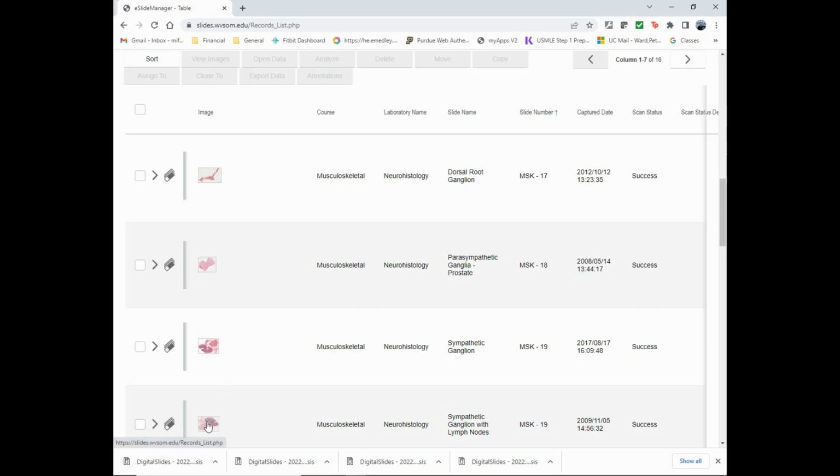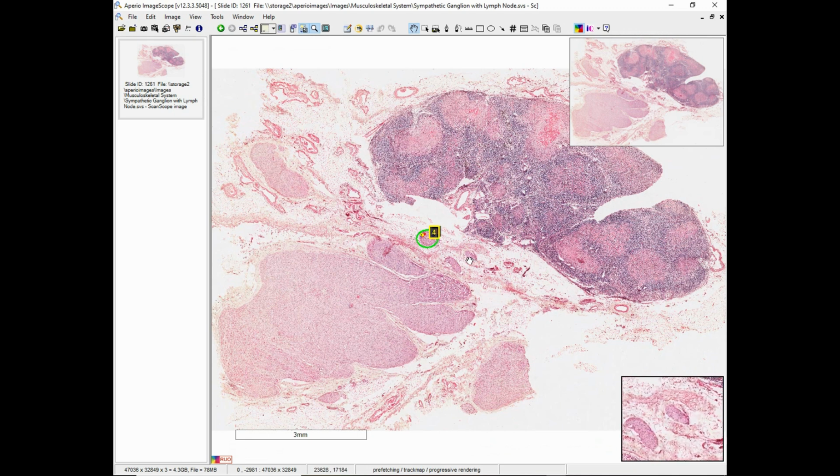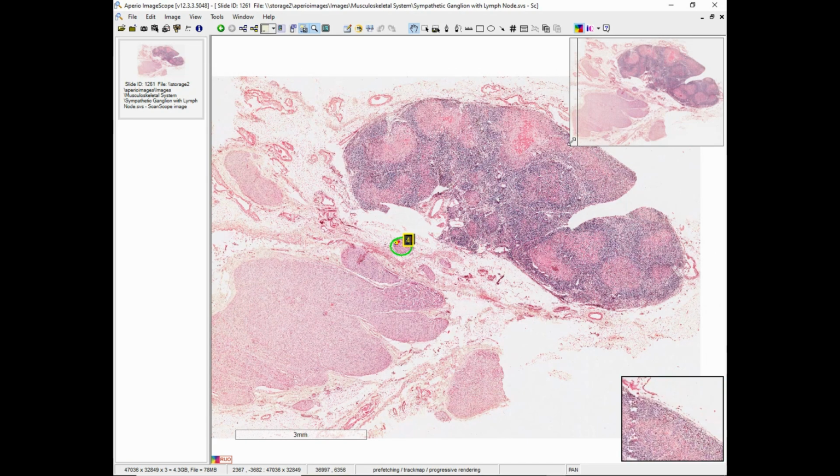And because I'm a sucker for completeness in these videos, I'm now going to take a look at the other kind of autonomic cell that we have, and this is a sympathetic ganglion. Sympathetic ganglia are going to have different effects than the parasympathetic nerves, and you'll learn more about that in various other classes and courses.